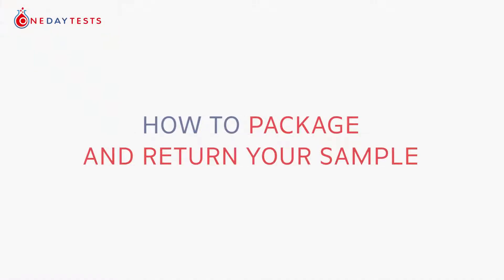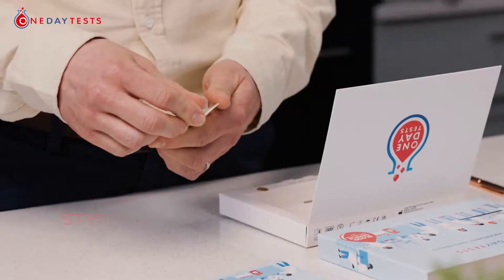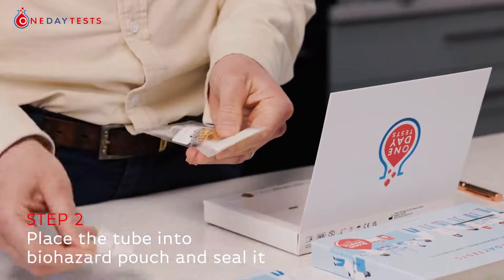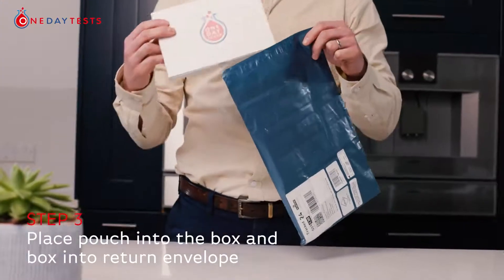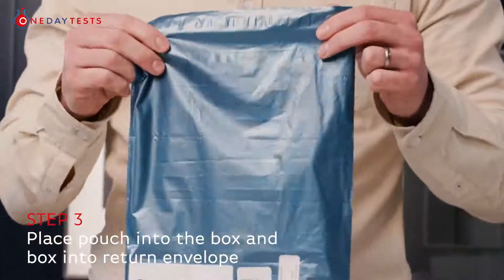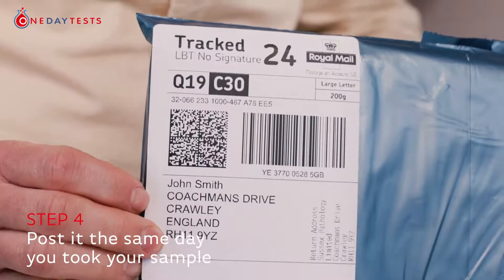To package and return your sample to our laboratory for testing: clearly write the time and date of sample collection on the label at the back of the biohazard pouch. Place the tube into the biohazard pouch, peel off the strip on the top and seal the pouch. Place the sealed pouch into the box and then place the box inside the plastic postal return envelope. Post your parcel the same day you took the sample — do not post on weekends or prior to or during bank holidays.